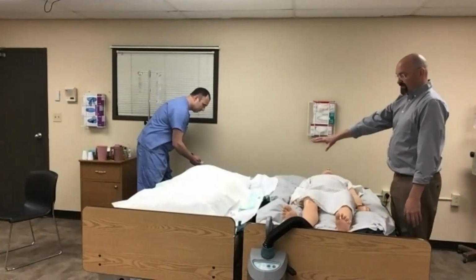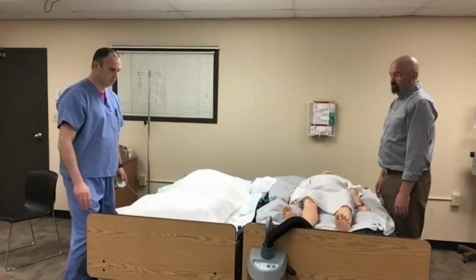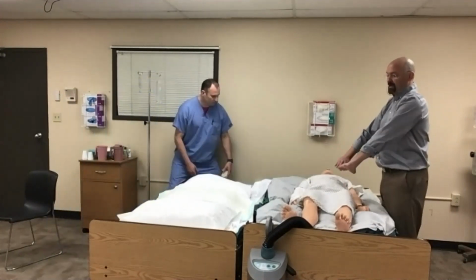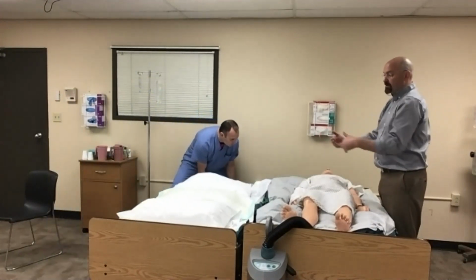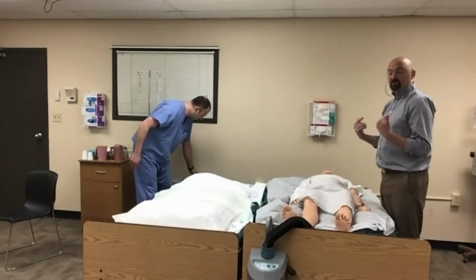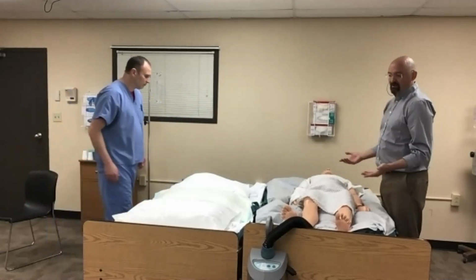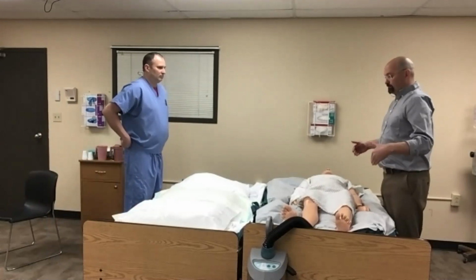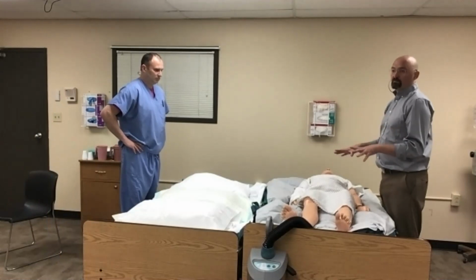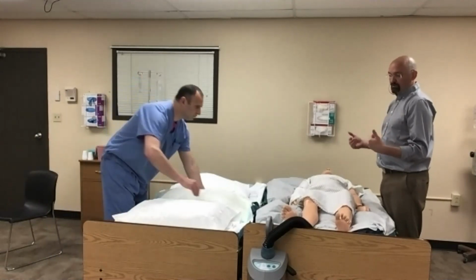We're going to lower that surface down about 3 to 4 inches lower than you would normally go, because we're going to prone this patient onto the top of those pillows. The bigger your patient, the faster that patient will turn. Be very aware of that. In this case, our patient is relatively light, so they're not going to turn very fast at all. The heavier patient, this is ideal when you have that larger patient with a large thigh mass or a large abdomen. This makes it so much easier to prone that patient.